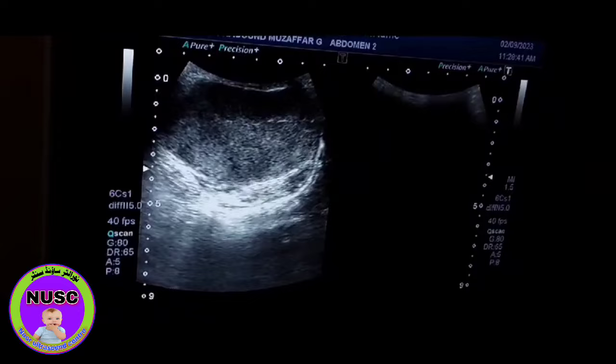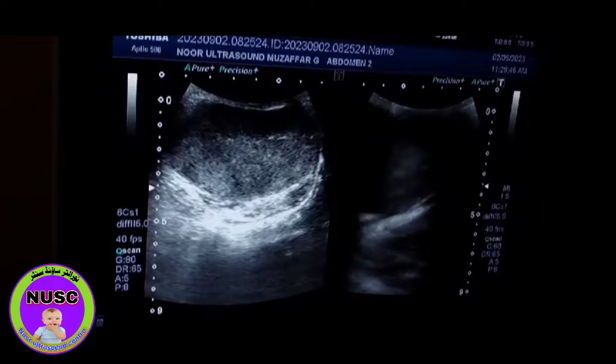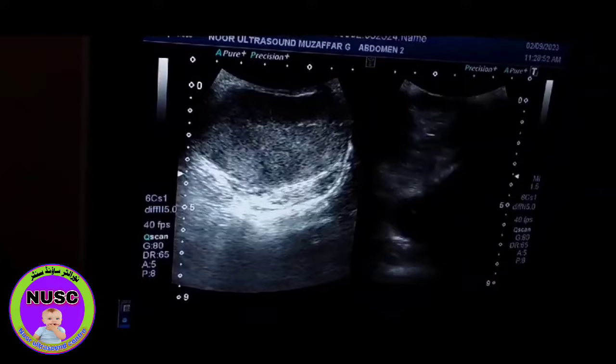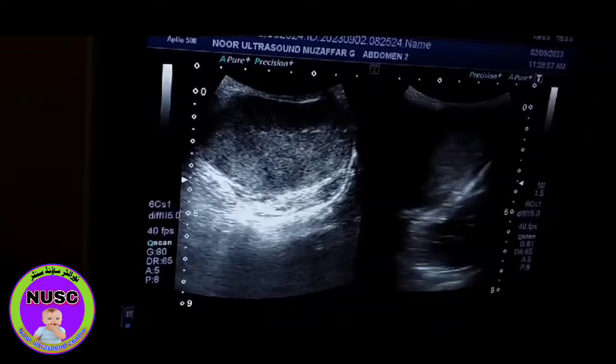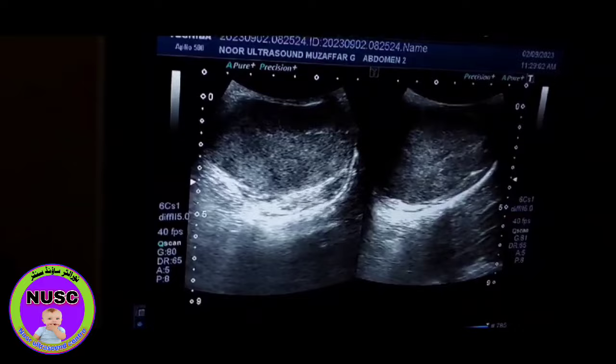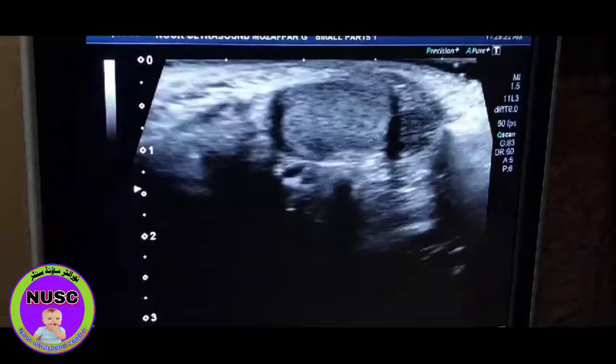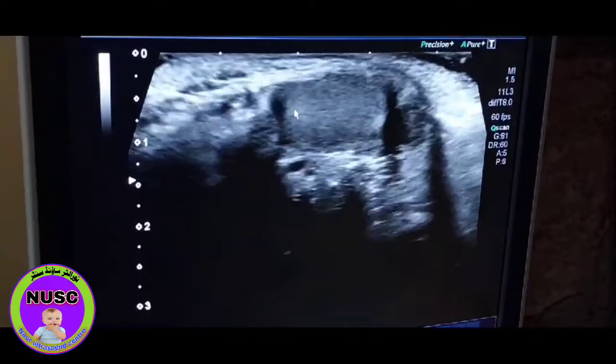The right testis is present and normal looking. Because I was using a low frequency probe, but now I am using the high frequency probe. And as you see here, this is the right testis, which is normal looking, having no pathology.